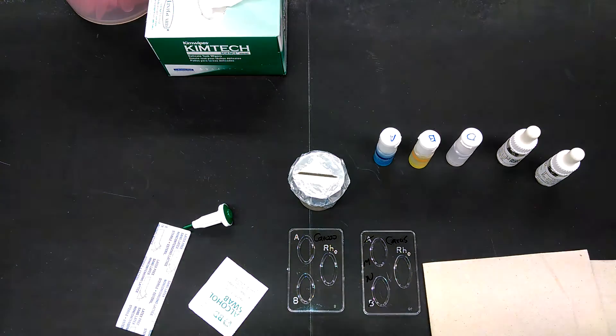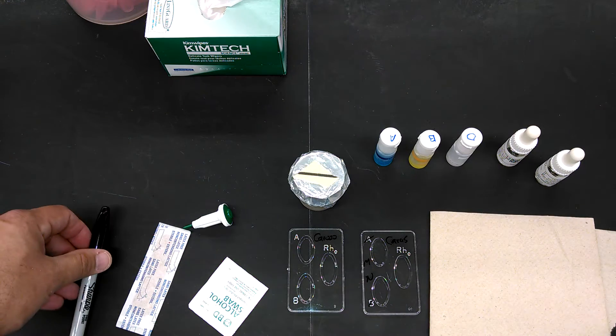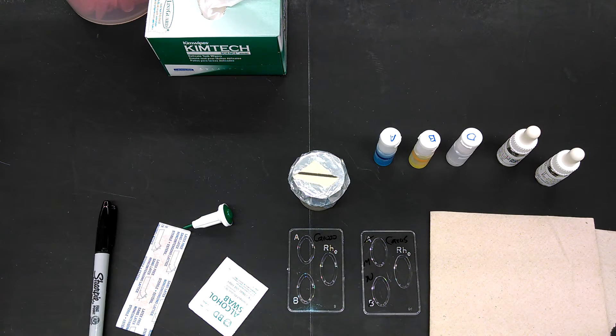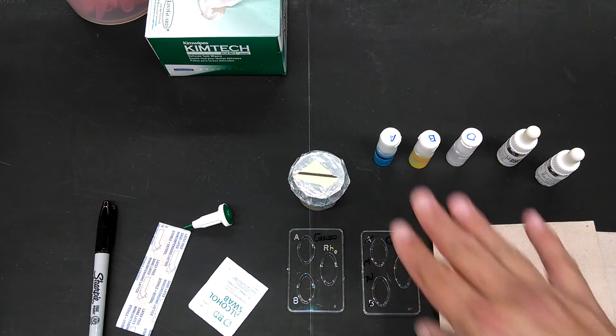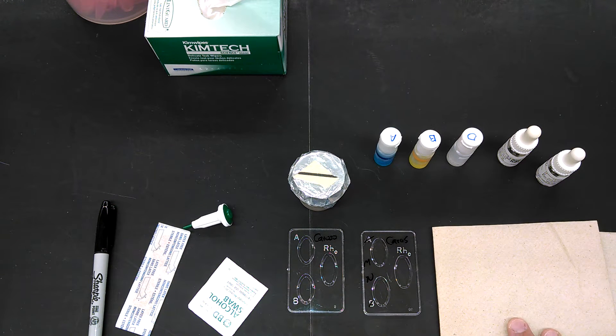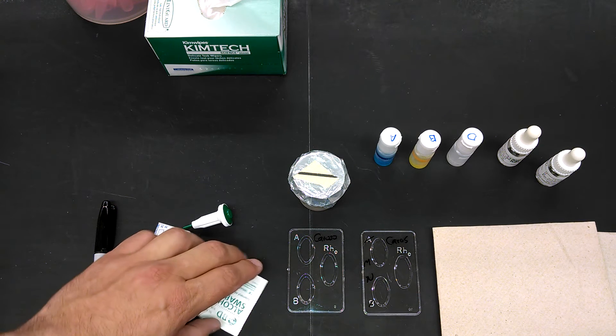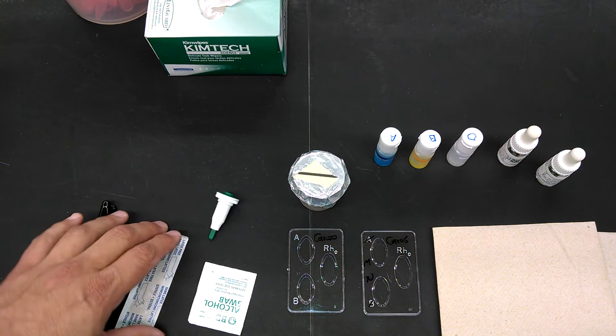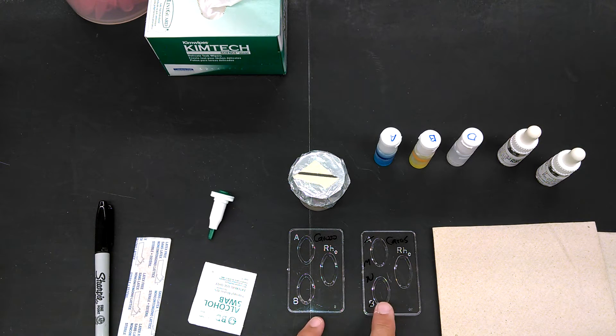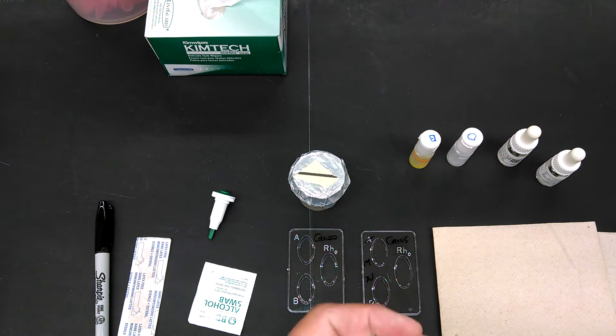You want to get everything ready because you don't want to be running around with a finger that's bleeding a little bit trying to find the things that you forgot. The antibodies are going to be up in ice buckets. They're not going to be at your table, and you should leave them there because everyone's sharing the same antibodies. The rest of it you can get and bring to your desk. Before you get started, bring your trays up to the antibodies and get them ready first.